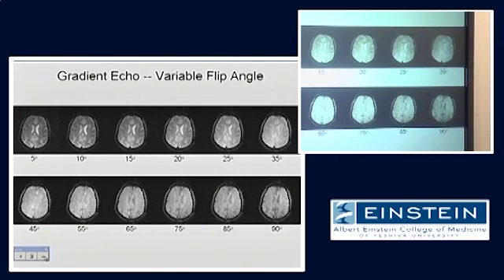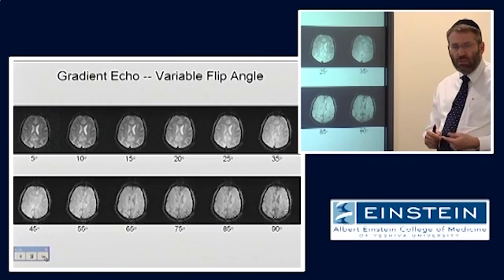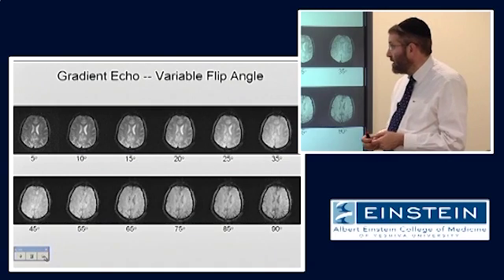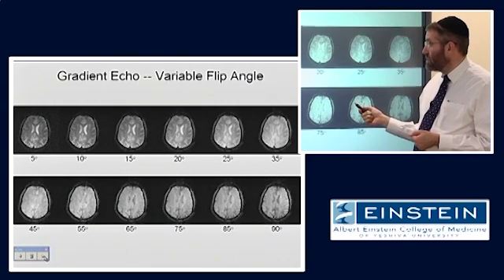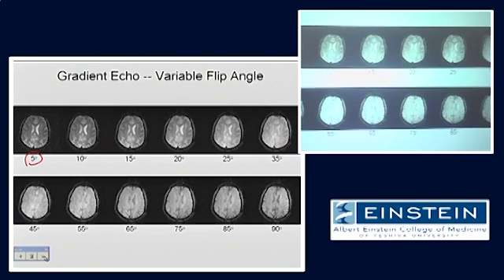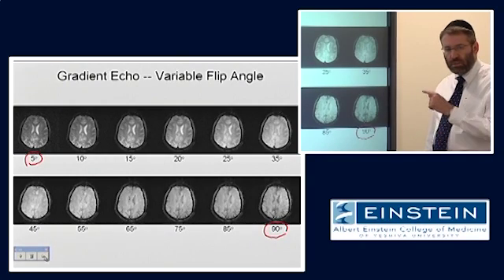right, so this is a series of gradient echo images where everything stays the same except for the flip angle. So in this case, the TR is 500 milliseconds. In spin echo imaging, at least, that would be a short TR, typically what we would use for T1 weighted images. And the TE is also short here, right? The TE in this case is 10 milliseconds. But if we narrow the flip angle sufficiently, we can completely suppress that T1 contrast that otherwise would be in the image if we used a much larger flip angle. Is this clear why this happens?